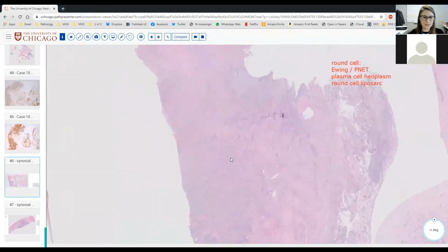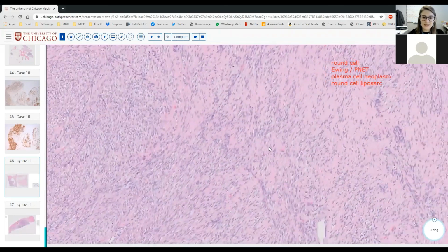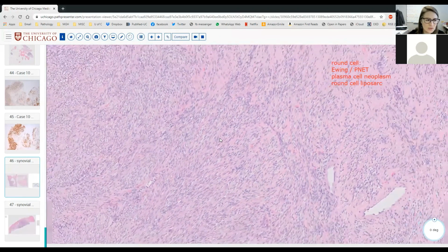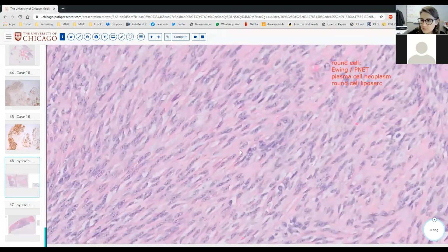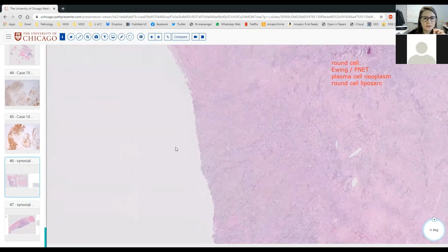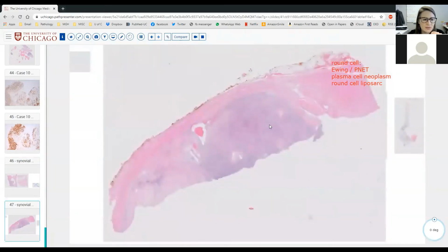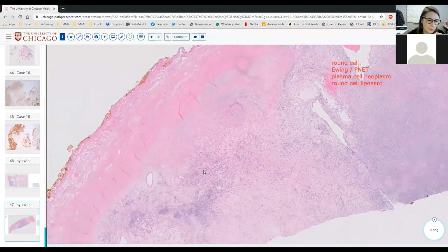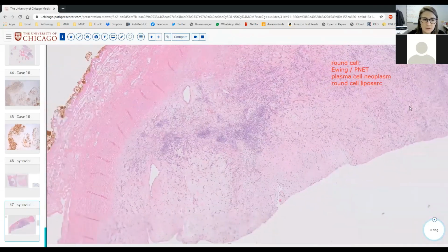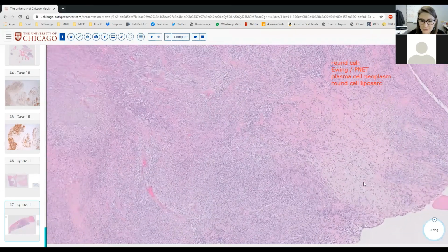This is the resection from that synovial sarcoma. And interestingly, on the resection, we see more areas that are much more classic spindled, right? Classic interlacing fascicles of relatively monotonous spindle cells with small nucleoli with a little bit of collagen in the background. So just remember that tumors can take on varying morphologies. Synovial is one of them that can be a little bit of a challenge if you have round cell morphology and don't necessarily think about it on your differential.